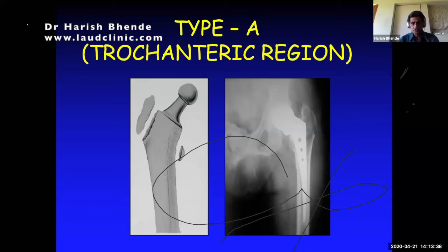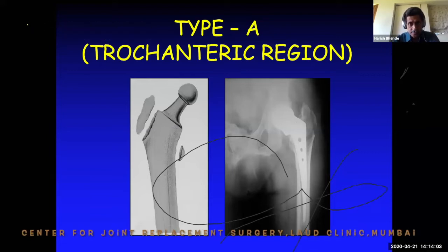So you have to be very careful to label a fracture type A in these cases, because you have to identify that there is no osteolysis, because osteolysis in the trochanter may also mean osteolysis distally along the shaft, and that may mean that you are entering into type B, not type A, where it's actually a loosened implant, and the fracture category may suddenly become B2 instead of A1.